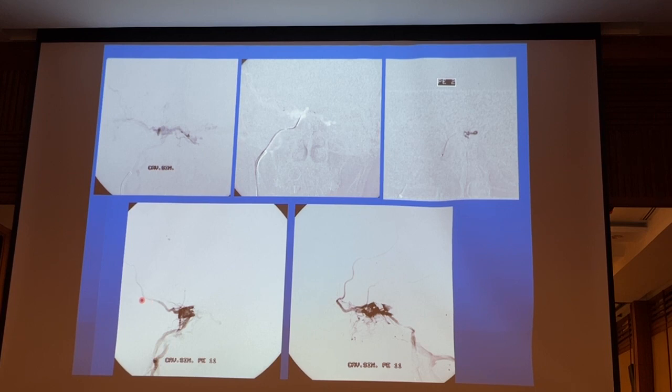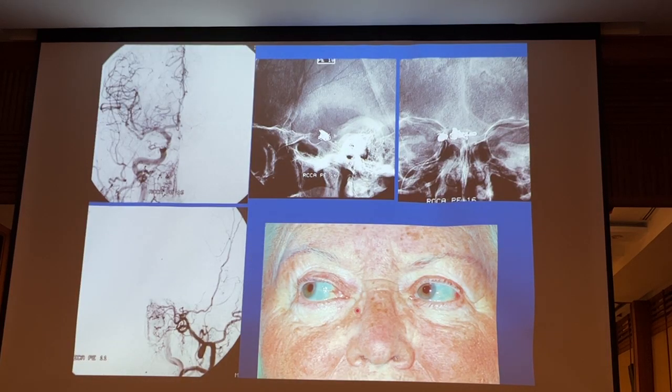So we are able to close this orifice of this middle cerebral vein, and we were able to close this shunt by putting the coils in the cavernous sinus. I prefer to use fibered coils. And this is a fibered detachable coil.